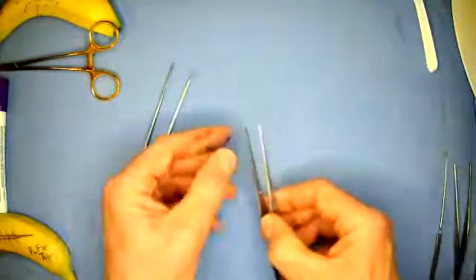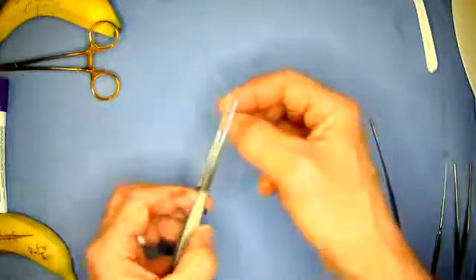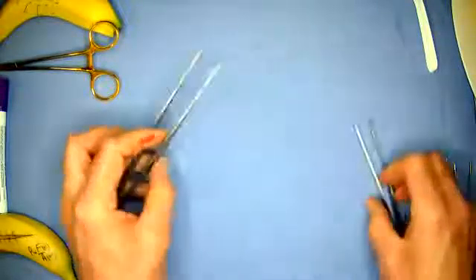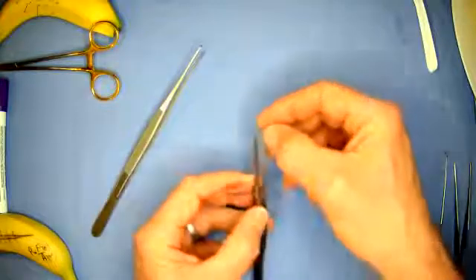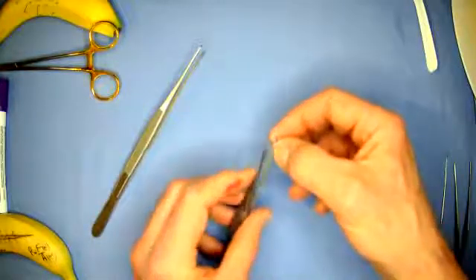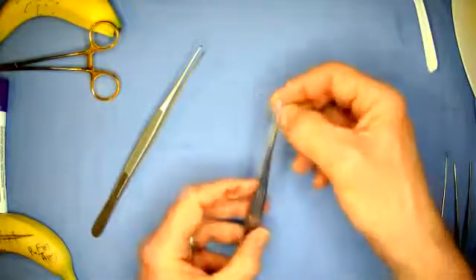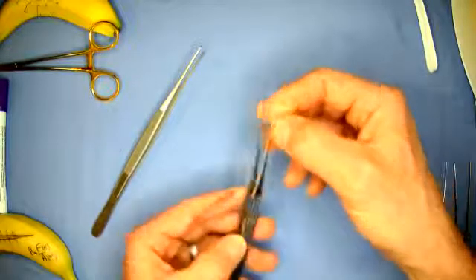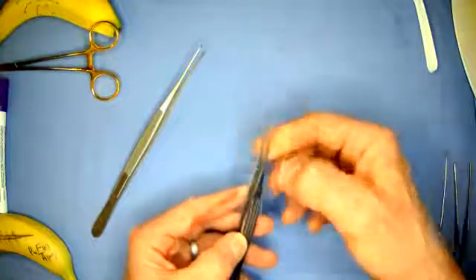The other forceps, well, Cooley's forceps, has got a row of 3 one side and 2 the other side that interdigitate. Now, the single tooth forceps is the Adson forceps, named after a famous neurosurgeon, and there's a rat tooth at the end interdigitating with another on that side.